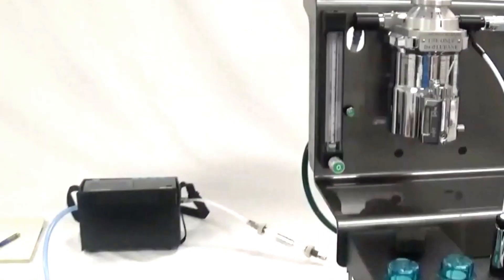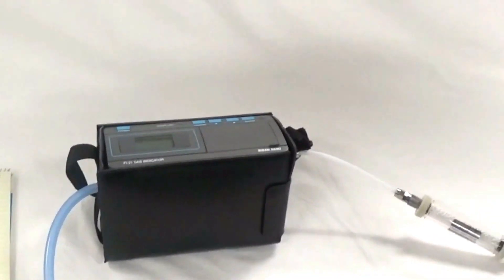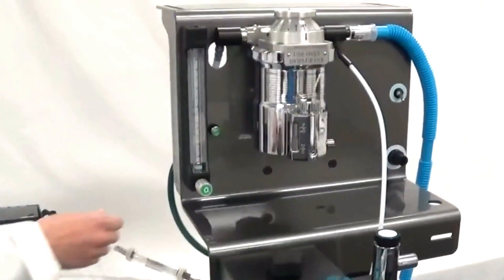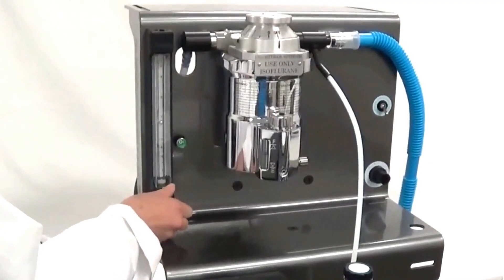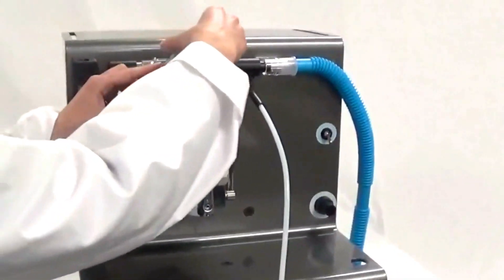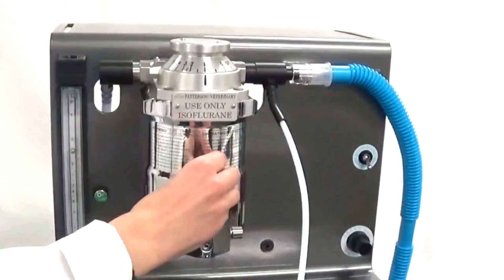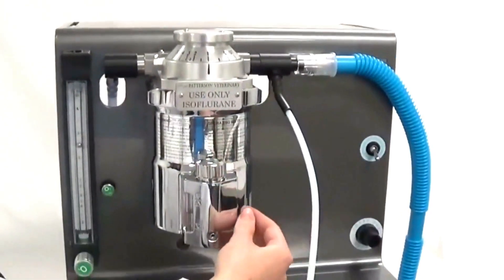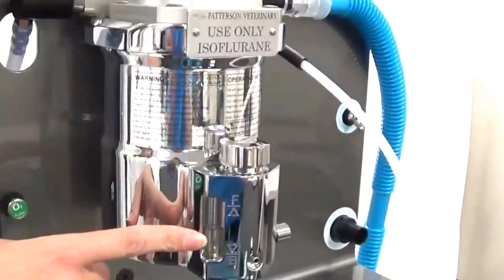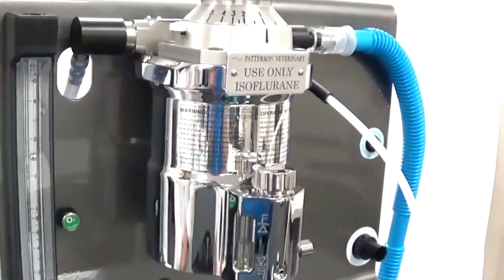With the Riken Fi21 still on after completing the Air Cal, we will now turn the oxygen flow meter to 2.5 liters of flow and the vaporizer to 1%. We will make sure the fill cap is tight and the drain stem is tight, and observe to ensure the anesthetic level is at least half full before performing the verification.